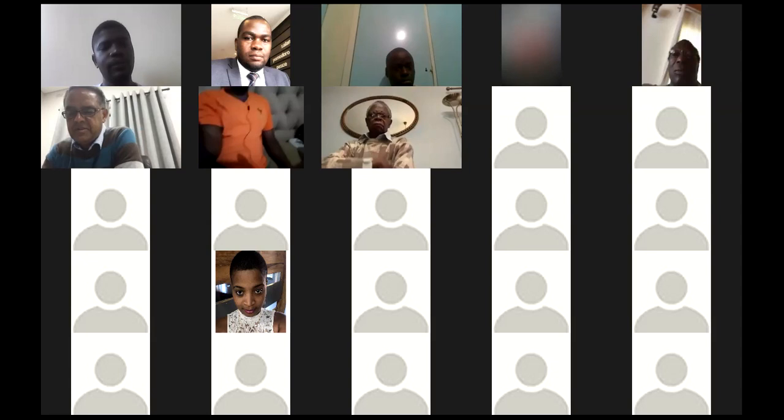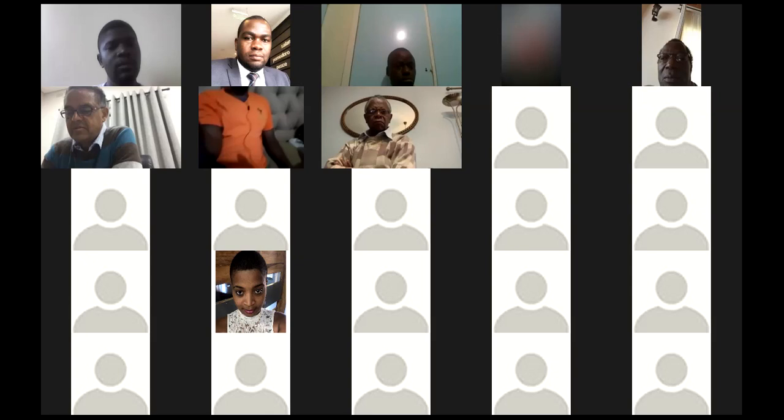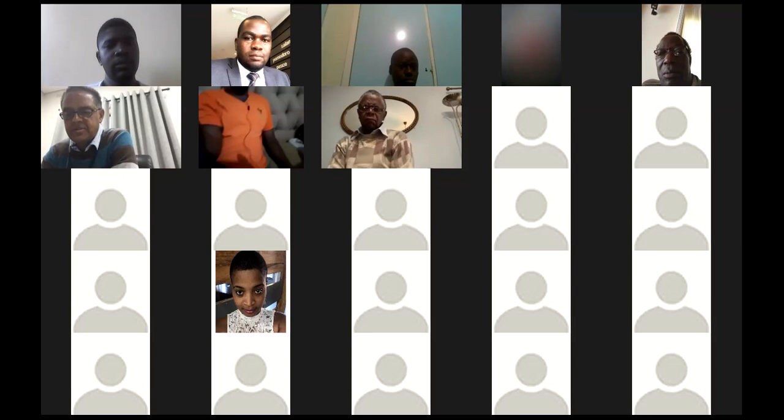So when you see a dysplastic hip, and even a very mildly dysplastic hip, like a Crowe A, there are a lot of pitfalls that you need to look at and pre-plan well before the operation. So don't think that this is a standard hip replacement. And certainly once you get to the more dysplastic ones where the femur is completely dislocated out of the acetabulum, that does require a lot of expertise. So just be careful when you're looking at x-rays of patients who have developed early arthritis, and make sure that you're not dealing with a dysplastic hip.